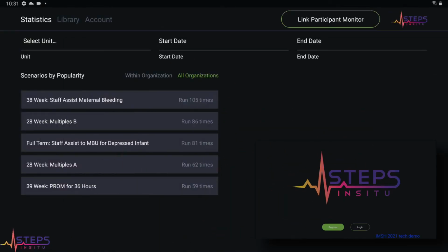I wanted to create something that can handle not just scripted responses, but any responses. I wanted to create real scenarios that I had personally experienced and built out every possible combination of actions. Add in the power of computing to alter the responses to the team's skill level, and you get a program which will provide a different experience every time you run it.